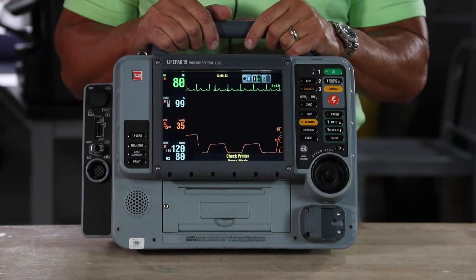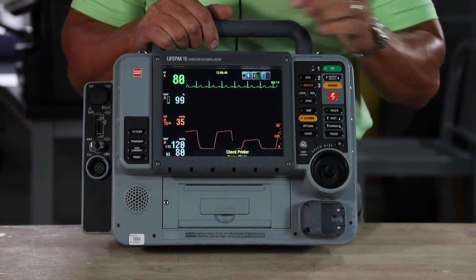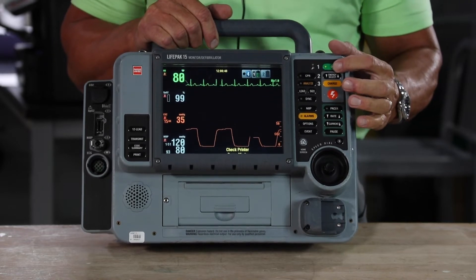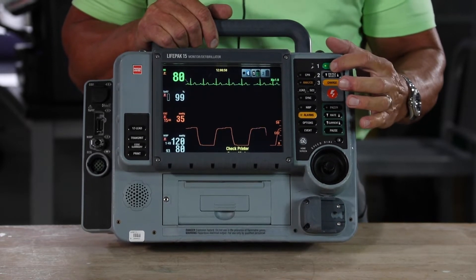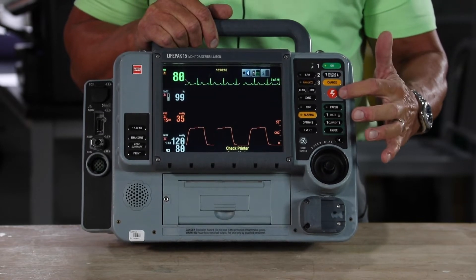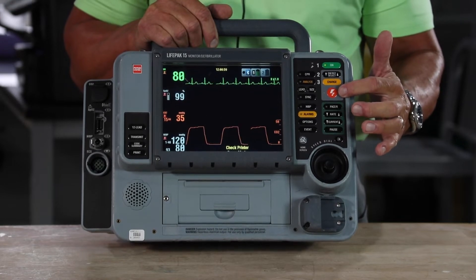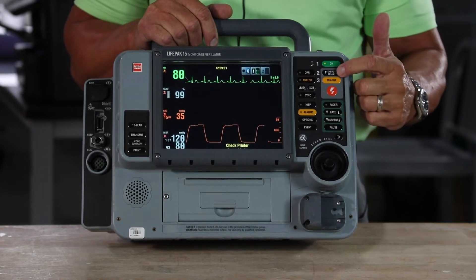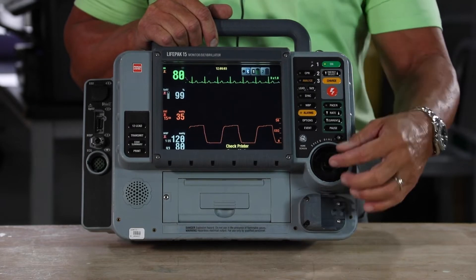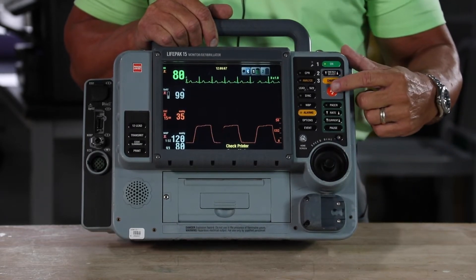One reason why the LifePak 15 is the easiest device on the market to use is because with one push of a button you're in each modality. With manual defibrillation, all the buttons are laid out in one area. Everything in gray is manual defibrillation, in the order in which you'd use each feature. Here's your energy select button up or down — you can use the speed dial to get there very easily — your charge button, and then your shock button.